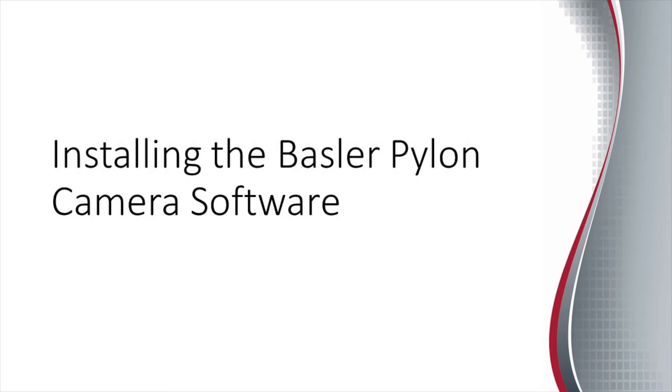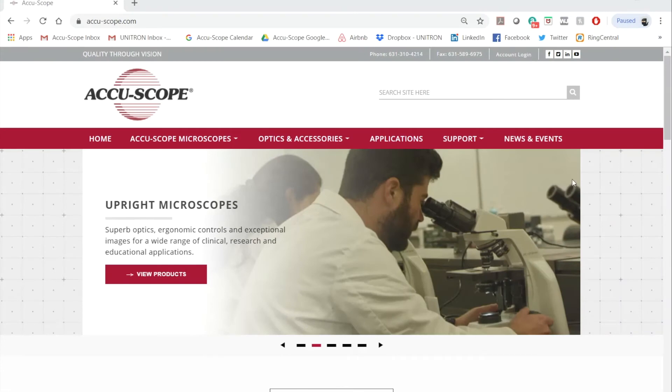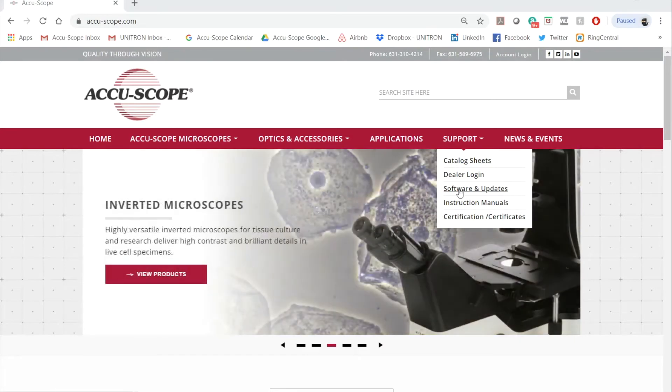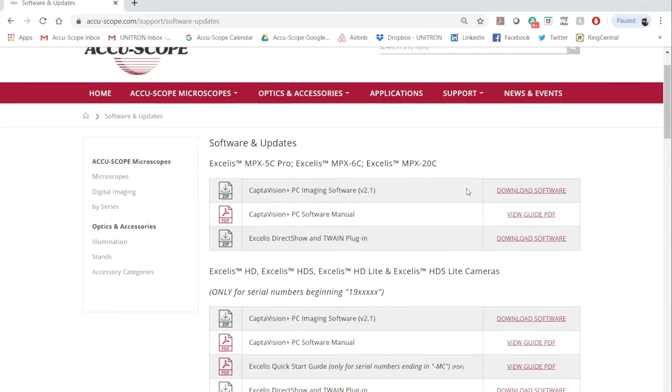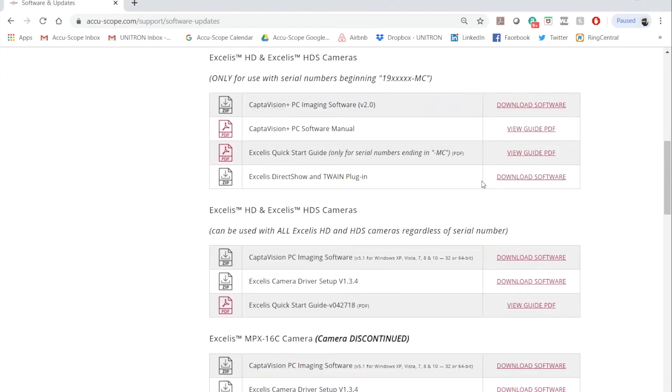The first step is to download the Basler Pylon software. You can find a download link on the AccuSlide website. Go to Support, then Software and Updates. Scroll down to AccuSlide MS.